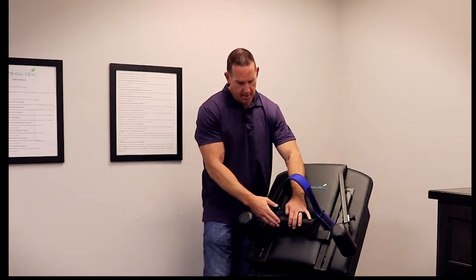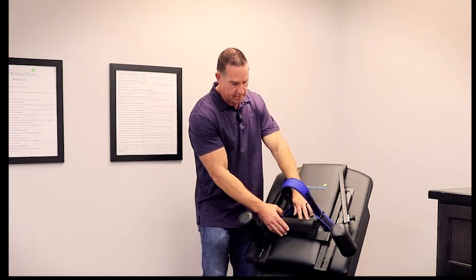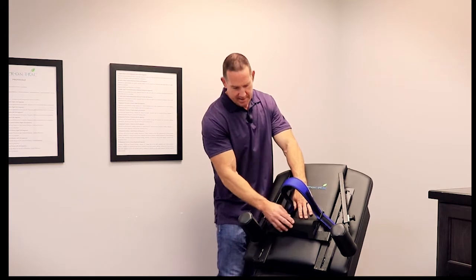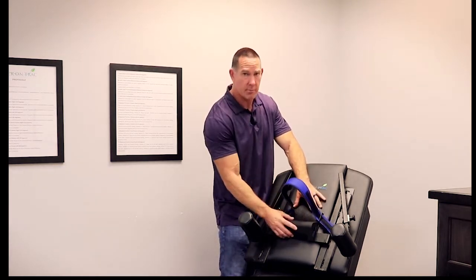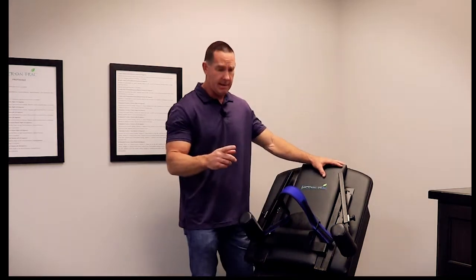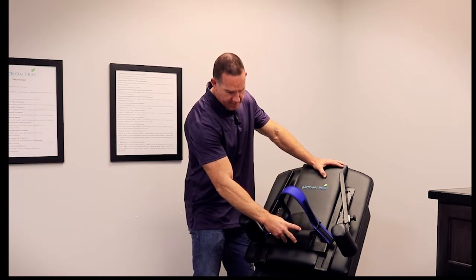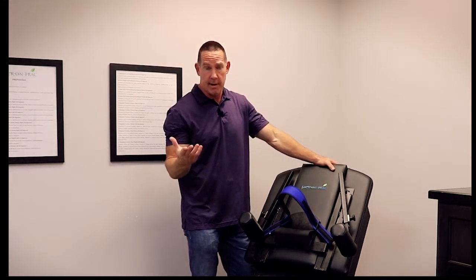I want to explain a couple things so that you understand. The difference between our traction unit and others like a Saunders is we basically have a Denneroll that's built into this thing that's going to support the curve. So this is not designed to hook the occiput — it's designed to put the head back to support the curve, and then we're going to use the curve to do the traction. A lot of doctors out there are using this to hook the occiput, and I can tell you from experience that's not a fun experience. I actually came off with a bad headache the first time we tried that.